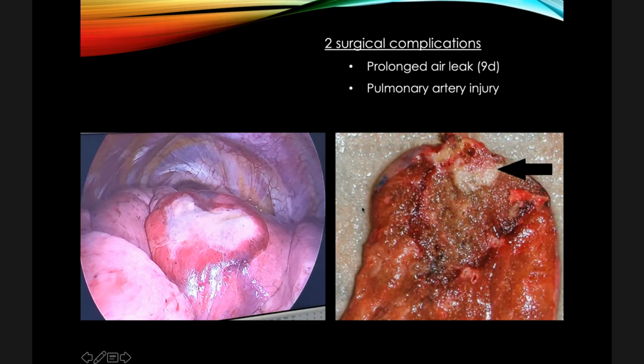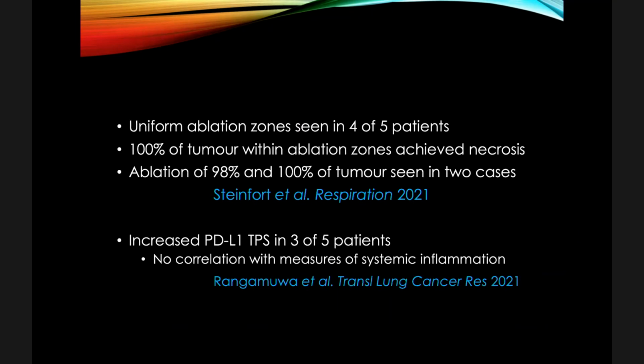Here is from a different patient, a resected tumour that sits well within the ablation zone. The tumour is noted by the black arrow, and there is obvious and uniform necrosis macroscopically around the tumour, with, again, a rim of hemorrhagic necrosis surrounding the ablation wedge zone.